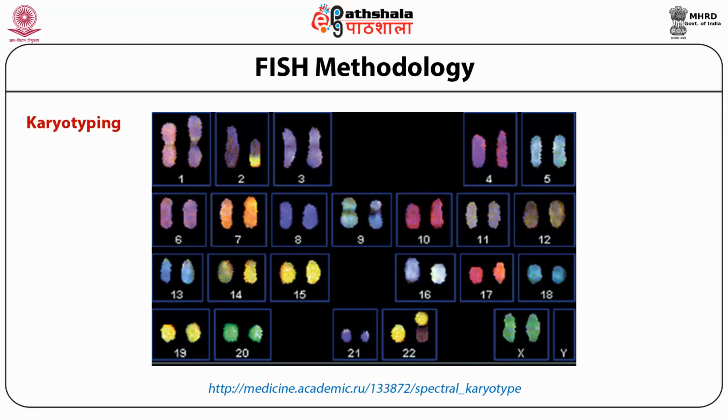You can also see if any fragment of chromosome number 15 has translocated to chromosome number 10 or 16 for that matter. So this method allows us to understand the genetic aberrations, any chromosomal abnormalities that are generated, and this technique is often used for screening the genetic deformities in the neonates or during pregnancy.